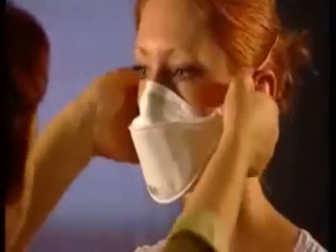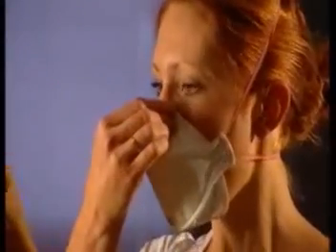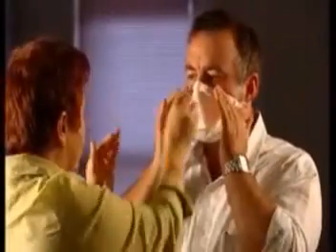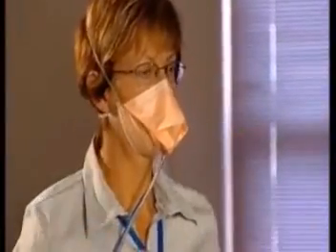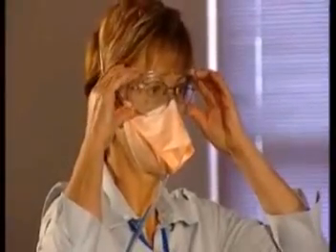Regardless of the method used, you can increase the chances of a successful fit-test if the person being tested has had previous experience with using a disposable P2 or N95 mask. However, lack of previous experience should not be a deterrent to performing a fit-test. The fit-tester should always use the fit-testing time to reinforce correct procedure for fitting and removing a mask. Protective eyewear can affect the seal and fit of the mask, so it should be worn when fit-tests are performed to ensure the mask's protection is not compromised.